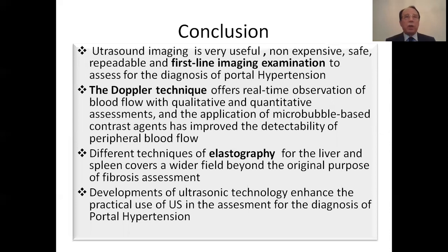As a conclusion, ultrasound imaging is a very useful, inexpensive, safe, repeatable, and first-line imaging examination to assess for the diagnosis of portal hypertension. The Doppler technique offers real-time observation of blood flow with qualitative and quantitative assessments, and the application of microbubble-based contrast agents has improved the detectability of peripheral blood flow.